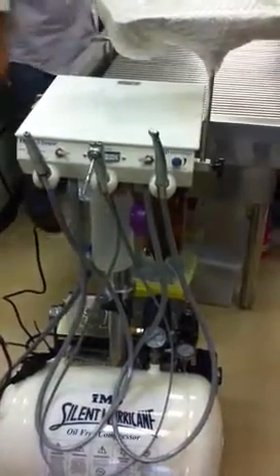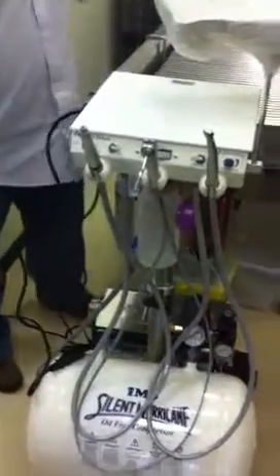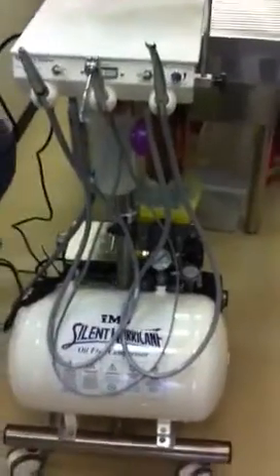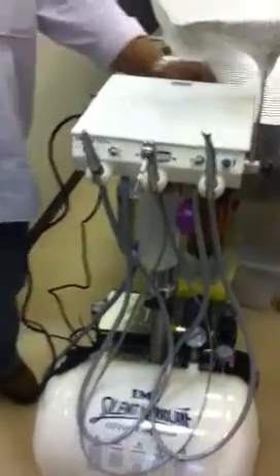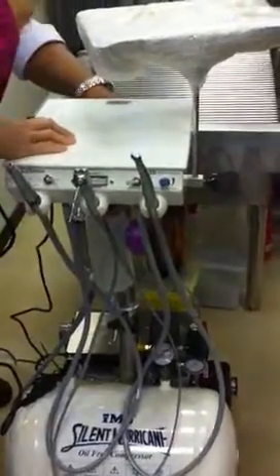The flexibility is you are able to connect. Can you do it for us later on? We don't have the connector yet. We ordered it from iM3 and it's going to be shipped from Australia. Basically the connector is a clip connector that connects to this one back here.